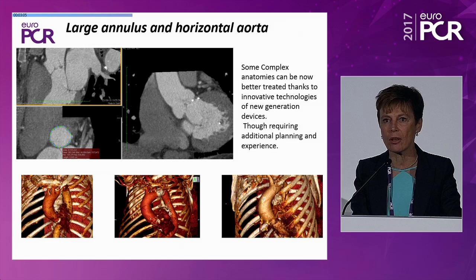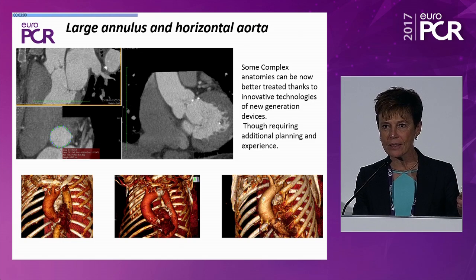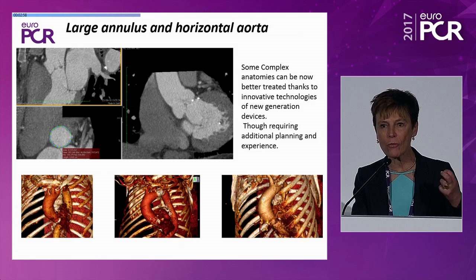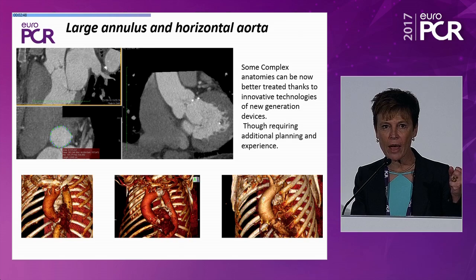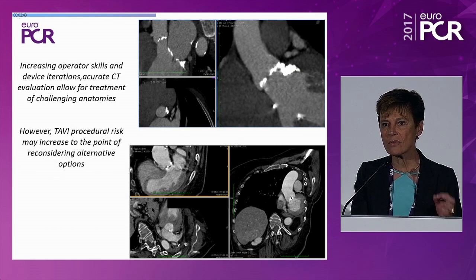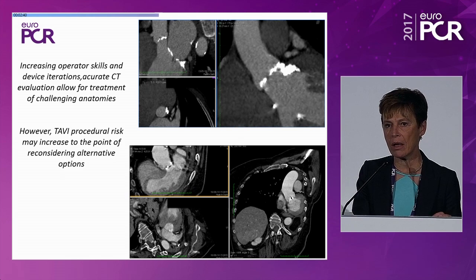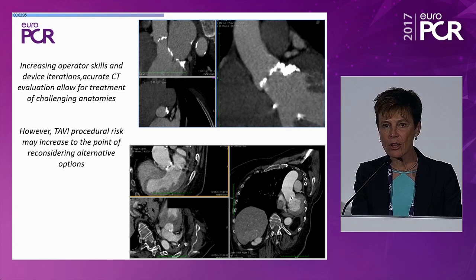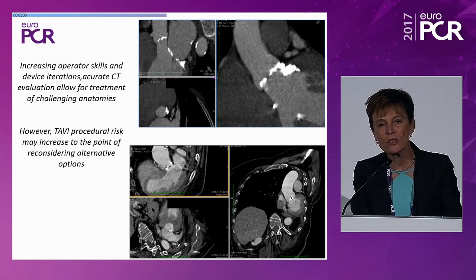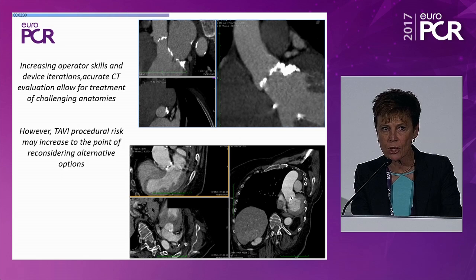Repositioning and recapturing, I would add, are a tool that you have in your hands, but the best thing is to plan a good implantation from the first moment, because retrieving a valve all the time is not a good thing to do. You have this option in your hand, hold it, but do not use it every time. Last was a very interesting observation by Nico on the problems of the LVOT, and especially on the distribution of calcification in the LVOT.